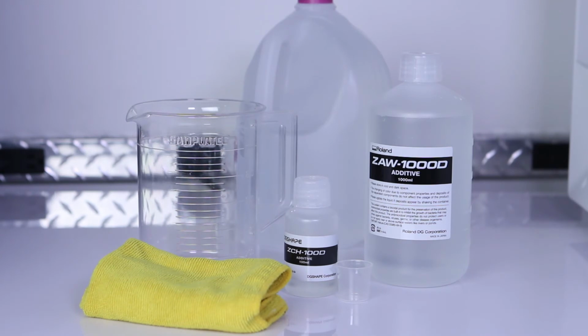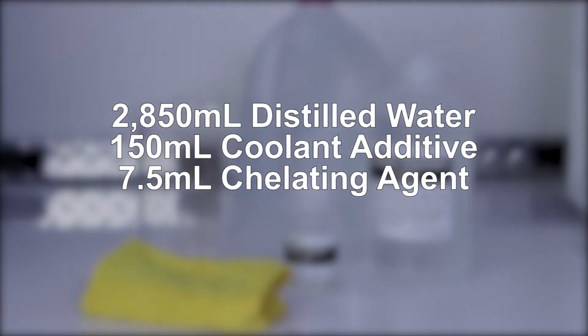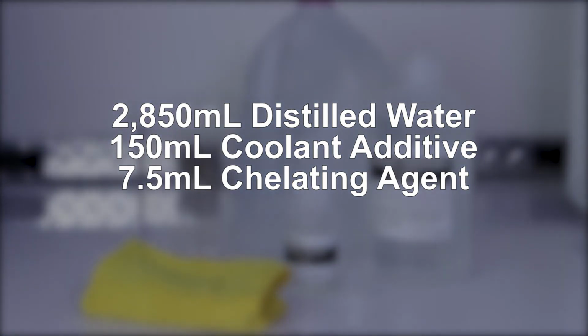To refill the coolant tank, you will need the coolant additive, chelating agent, distilled water, a dry cloth, a 1,000 milliliter measuring cup, and a 10 milliliter measuring cup. For a full tank of coolant, you will need 2,850 milliliters of distilled water, 150 milliliters of coolant additive, and 7.5 milliliters of chelating agent.